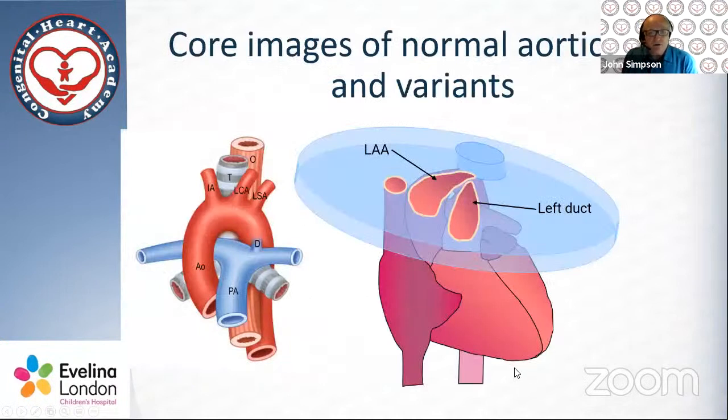So if we look at how we translate this view into what we look at generally on our fetal echoes and the upper mediastinal views, you can see here, as we look into the 3-vessel trachea view, we actually see a cross-section of the superior vena cava to the right here, left side of the aortic arch and left side arterial duct. I haven't shown the trachea in this image, but it would be over to the right here, so outside of this V formed between these 2 vessels.